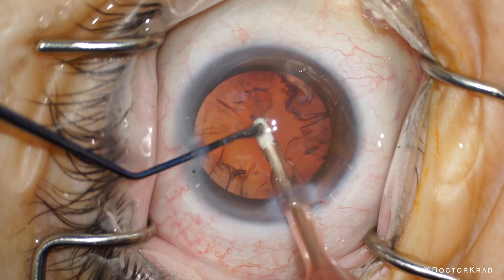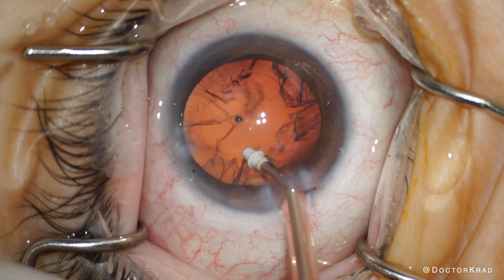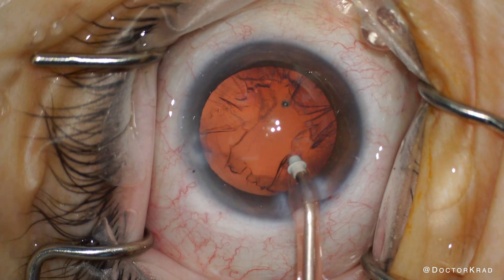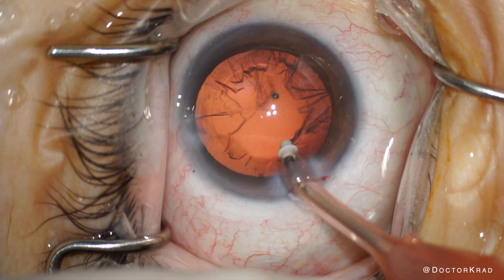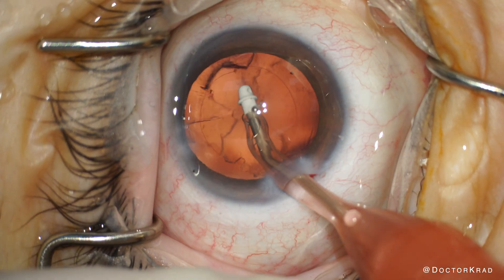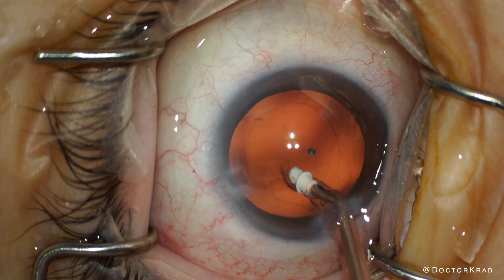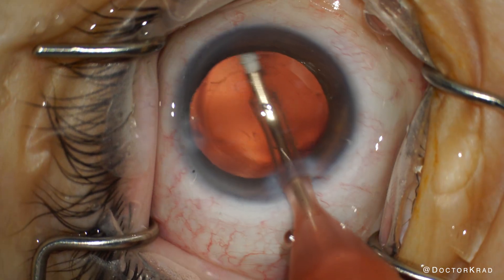I don't think femtosecond laser would have caused any harm, and perhaps it would help some surgeons with certain portions of the procedure, but knowing her history and that it would not impact her final vision, I think it would be wrong to charge beyond the cost for the laser. Am I wrong? What do you guys think? We still want to provide her with the highest quality surgery, but without adding a cost burden to the patient, so we're going to do a meticulous job.